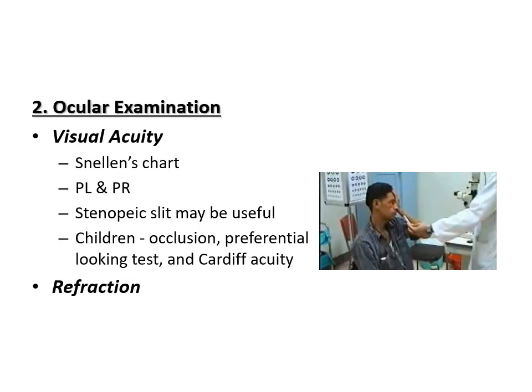So you take a proper visual acuity of the patient, preoperative visual acuity by a Snellen's chart. Sometimes the opacity or the pathology in the cornea would be so severe that the vision may be reduced to hand movement or even perception of light. In this case, you have to do a proper projection of rays for the patient. You can use a stenopeic slit to see how much improvement is possible, again, to prognosticate.